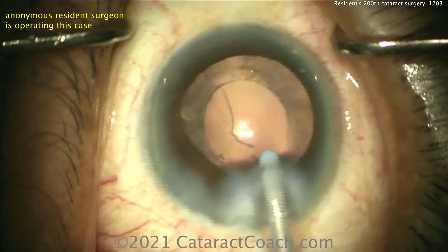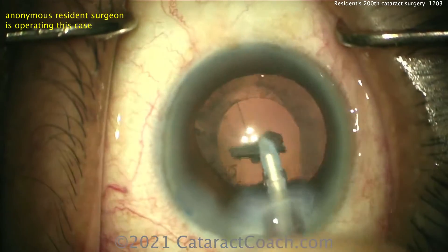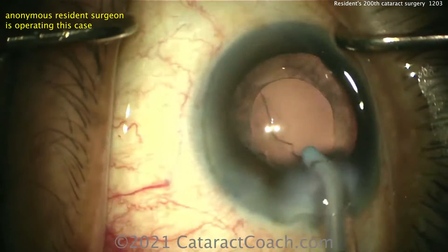So cleaning up that cortex — looks excellent. Just a little bit left. That epinuclear shell came out nicely. Again, the subincisional area is a little bit more of a challenge, but you're doing a really good job.